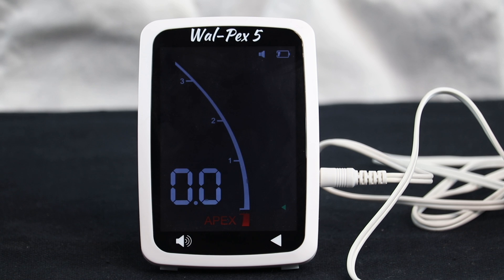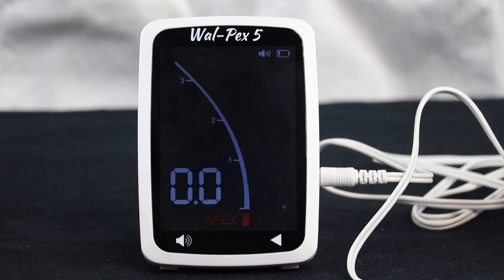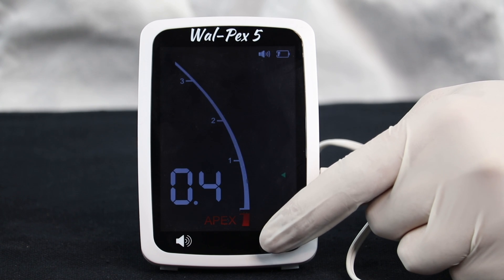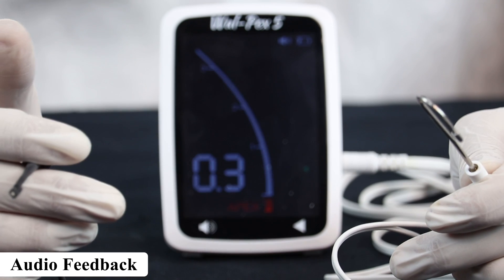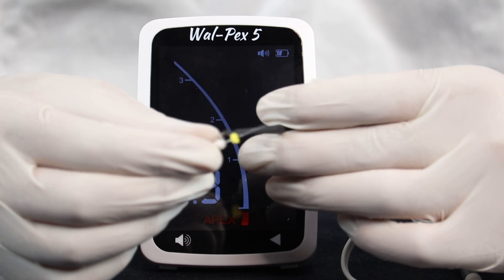Touch the volume button to select different volume settings, and the arrow to set the reference point. Check if the circuit is complete by connecting the lip hook to the file clip — the sound tells us that the circuit has been formed. Attach the file clip to the metal shaft of the file.